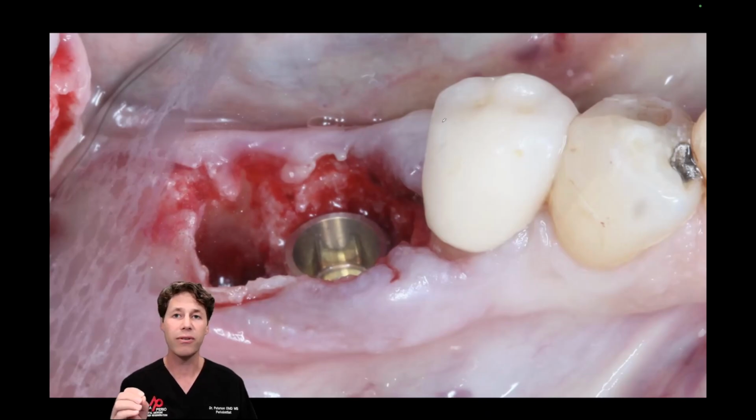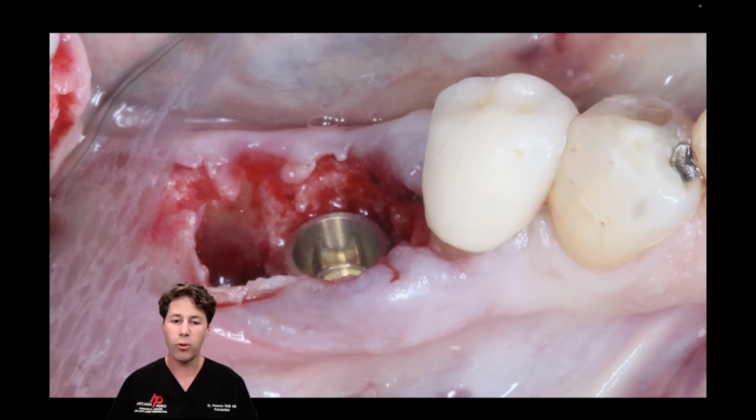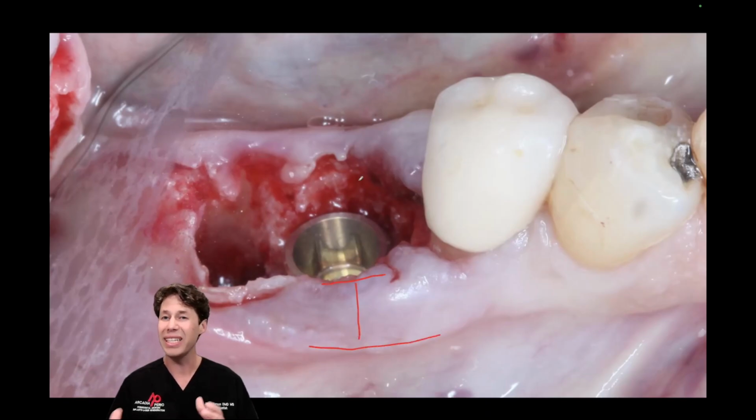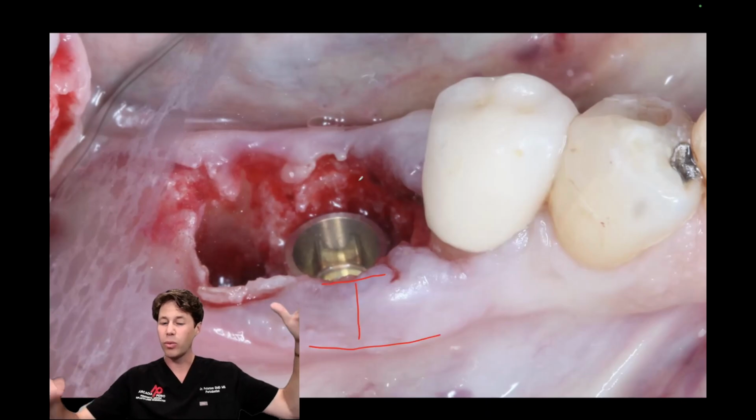The reason why I elected for a 5.5 is because it comes with a PEEK abutment, something that's going to give me a really nice emergence profile. That's about 6.5 millimeters wide by about 7 millimeters deep. So you can see from this photo, like we had talked about before in terms of the bone depths, I'm about 4 millimeters from my free gingival margin with a good band of keratinized tissue. But again, look at the difference because of the slope from buccal to lingual, and notice how much deeper I am on the lingual portion.